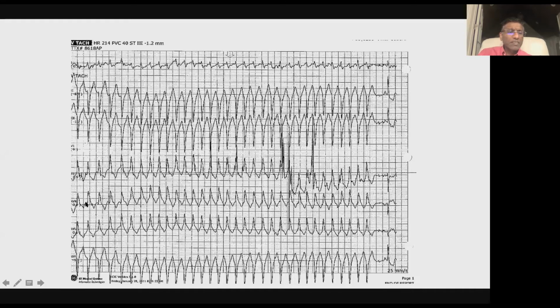Are you referring to this little glitch here? Yes. Ah, okay, I see what you're saying. I see that there's something there that looks like, maybe that's a P wave, don't know yet. We'll find out. And then after that, you said maybe it's a sinus tach. And so do you think there's one of those for everyone?